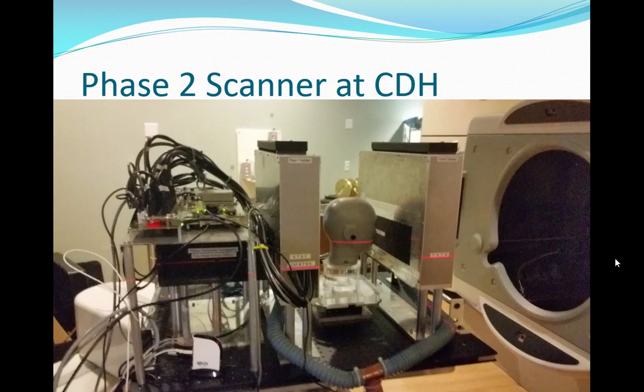And you can see there's always a laser alignment. This is a laser built into the room, and that tells you where the center line of the beam is. Now the beam will move around, this laser doesn't. This tells you where the center of this big circle where it comes out is, and we call that the isocenter. That's the center of where your treatment volume is, because you always want to line up to that center.